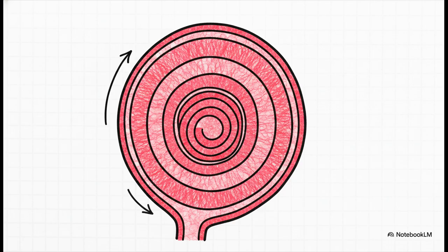It's a striking visual. Or consider an intussusception, which is where the intestine kind of telescopes in on itself. On a plain standard film, it might just look like a dense sausage-shaped mass. Kind of vague, right? But if you administer a barium enema, it outlines the layers of the intestine and creates this highly specific, highly memorable visual cue that we call a coiled watch spring pattern. It brings that dense medical terminology right to life.